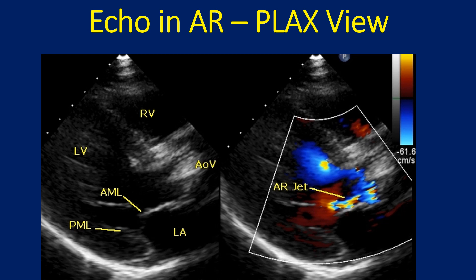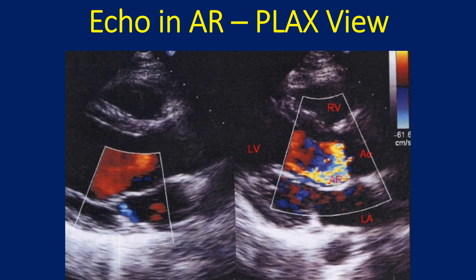This parasternal long axis view from another case shows the aortic valve as grossly thickened and calcified. The right panel shows the multicolored jet of aortic regurgitation along the ventricular surface of the anterior mitral leaflet. This is quite an eccentric AR jet, making severity assessment difficult. Another eccentric jet of aortic regurgitation is seen going along the posterior margin of the left ventricular outflow tract. The anterior mitral leaflet shows reverse doming as the aortic regurgitation jet strikes it. The systolic frame also shows a trivial mitral regurgitation jet into the left atrium as a bluish mosaic jet.